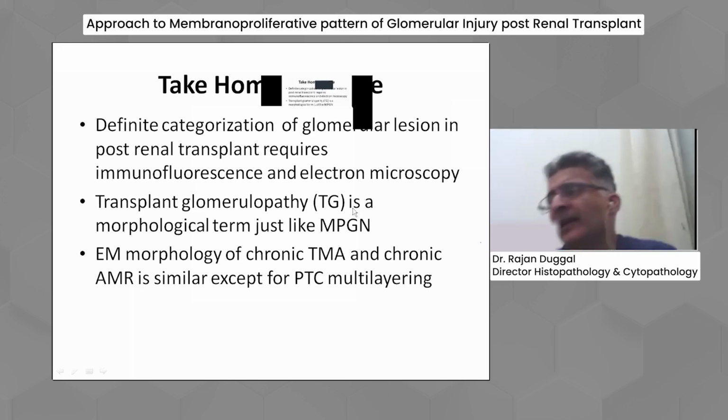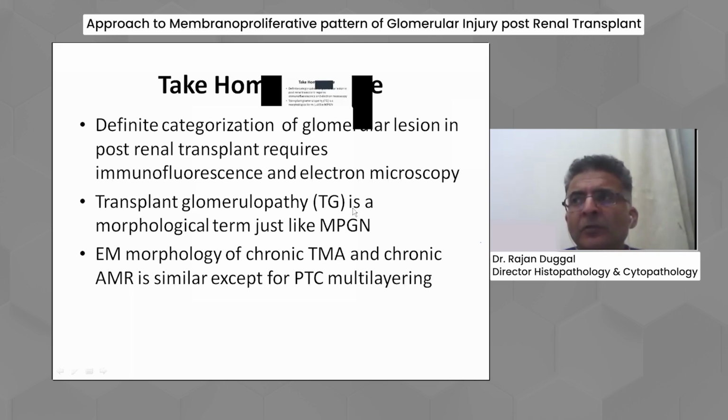As I've told you, I'll get a TMA in 1 or 2 glomeruli, and that TMA will involve only the glomeruli which are affected, like 2 glomeruli out of 10 are showing TMA. Those 2 glomeruli will show a very segmental involvement of the glomerular tuft. It will not be 100% of the glomerular tuft which is involved. The other thing is, in CNI-induced TMA, the glomerular hilar vessel will also show vascular TMA. You will mostly not find interstitial blood vessels with TMA.